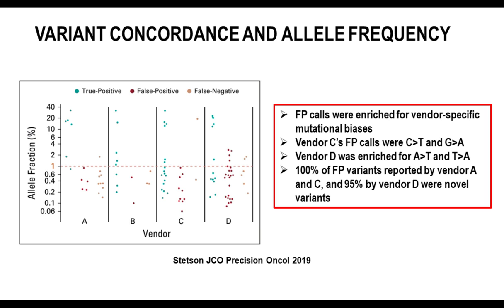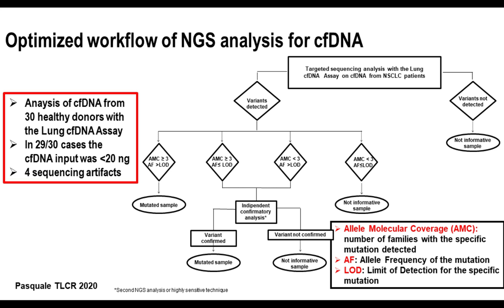So how can we overcome this problem? How can we clearly solve this problem? Well, there is no general suggestion that I can give. I can show you what we have done when we wanted to introduce liquid biopsy testing with the NGS in our clinical research. What we did, in particular, was first to test a cohort of healthy donors using this cfDNA assay based on AmpliSeq technology and specific for lung cancer.